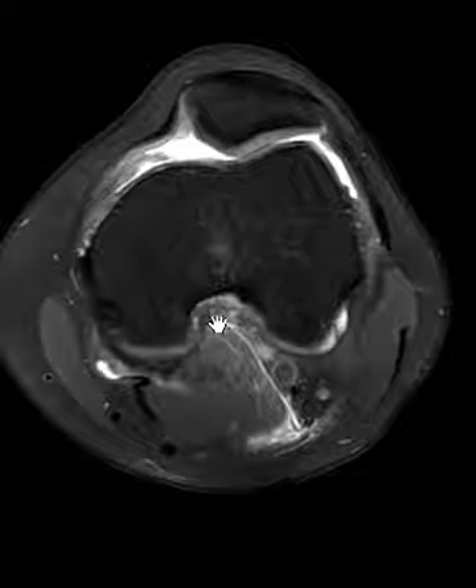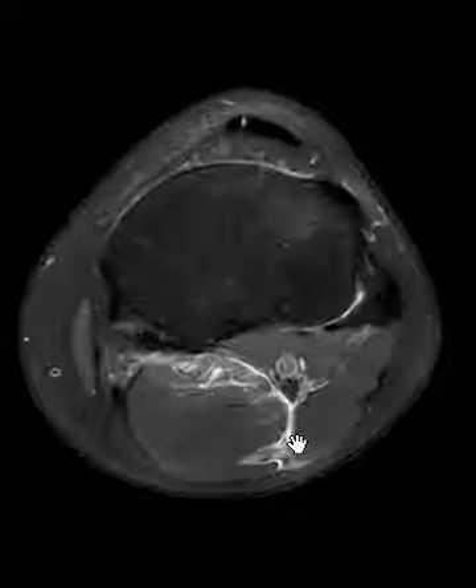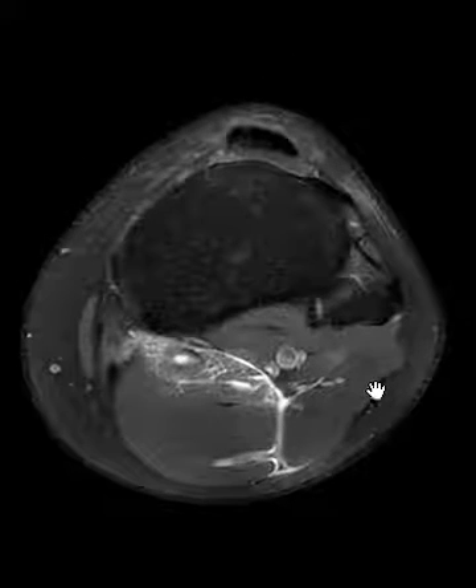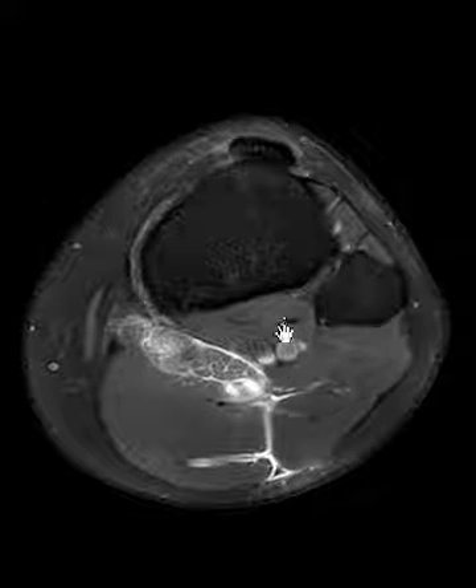But we also see something back here — this is the main finding. We see some fluid between the calf muscles. Here's the lateral gastrocnemius, medial gastrocnemius — see the fluid insinuating between there.